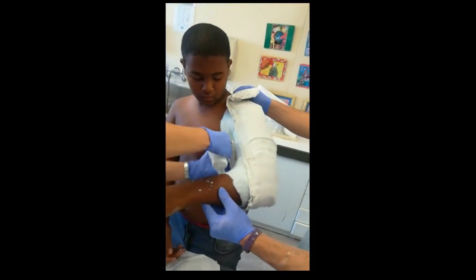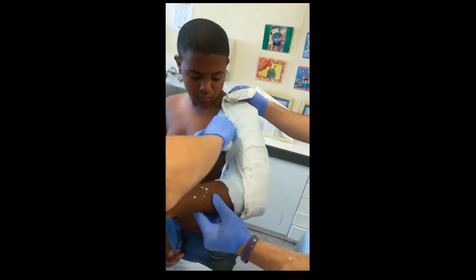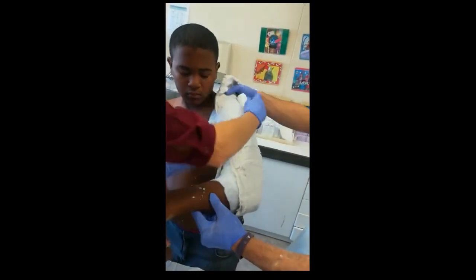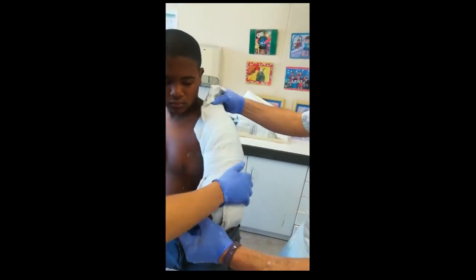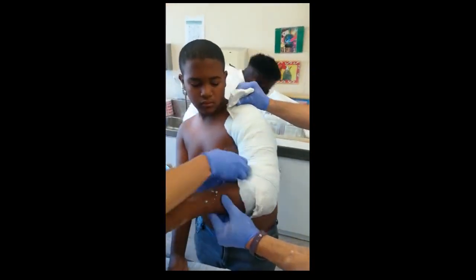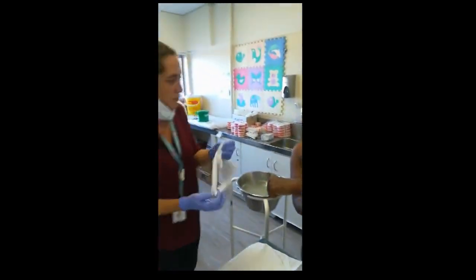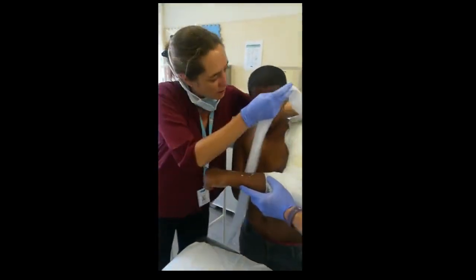Next, you take your bandage and wrap it around the arm to keep the U in place. Wrap it quite tightly, because this plaster works almost like a sugar tong in immobilizing from the two sides. Now this is a crucial next step — you remember we made this extra little flap at the top.